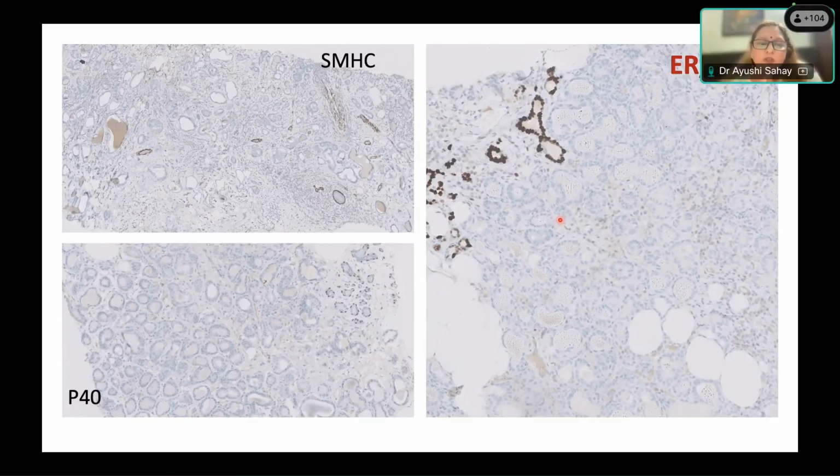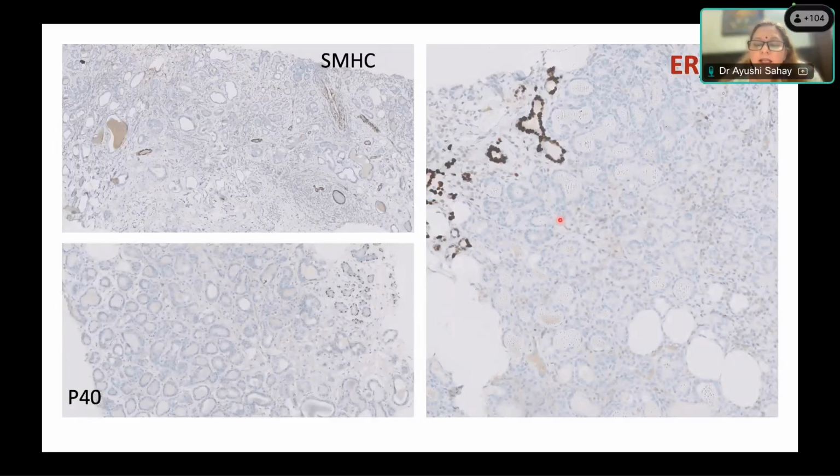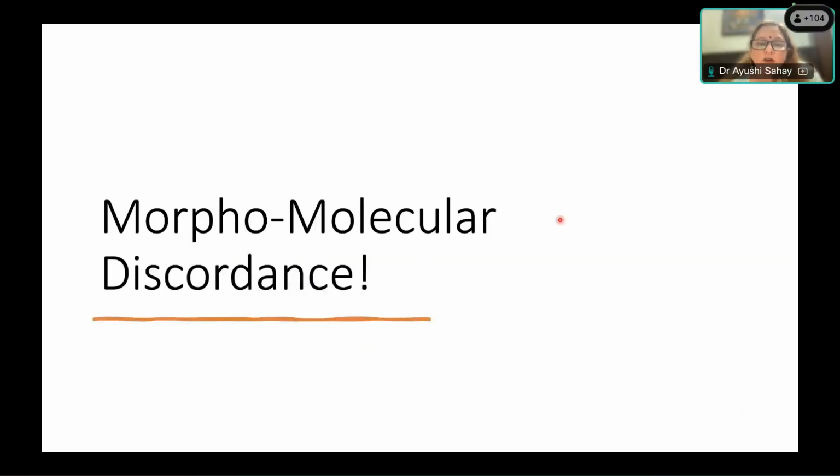Tubular carcinoma. Because the most common differential of an MGA in this kind of condition, a low grade looking glandular proliferation, is a tubular carcinoma most of the time. And if you have diffuse ER positivity in a tubular carcinoma, and here you're thinking of tubular but your ER, PR are negative, that makes for what we call a morphomolecular discordance, then you cannot have the diagnosis of a tubular carcinoma. So that is definitely completely ruled out. And then you need to think of the differential.